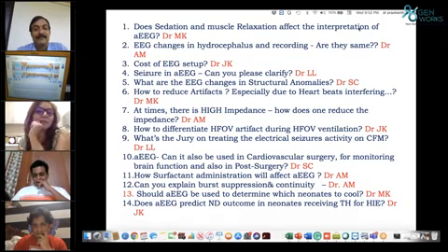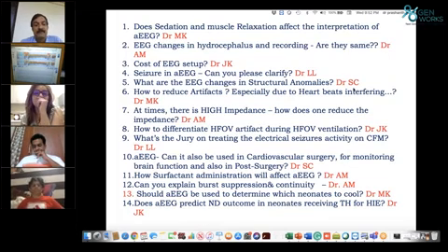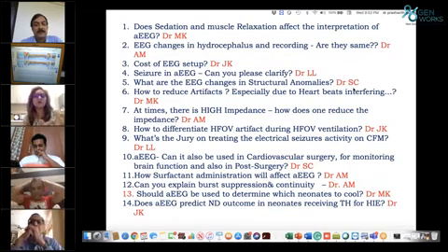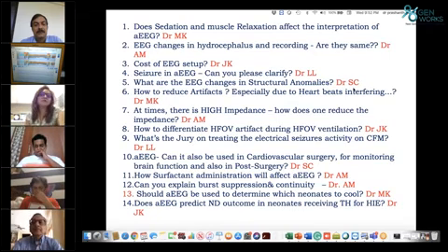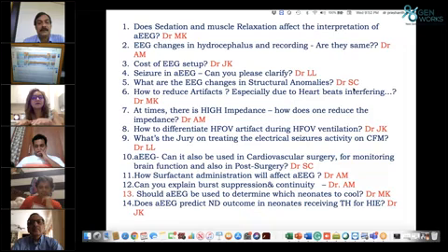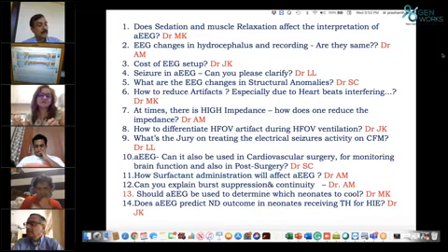So, the background amplitude can be altered by many medications. Especially we should know that when we are giving hypothermia, the half-life of these medications is going to increase, so this is going to be a prolonged and longer effect. Medications like chloral hydrate, or anticonvulsants like benzodiazepines or barbiturates, are going to inhibit the EEG amplitudes. So this we should know. Usually the inhibitions are quite transient and for less time.